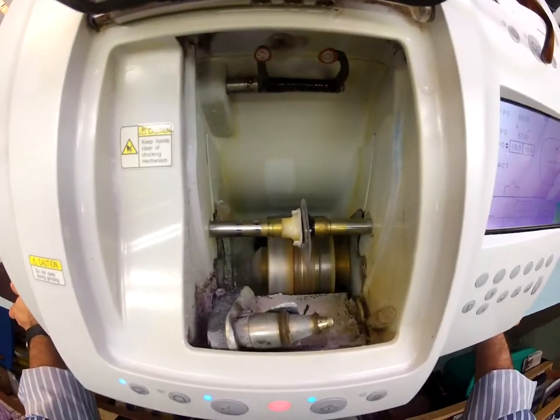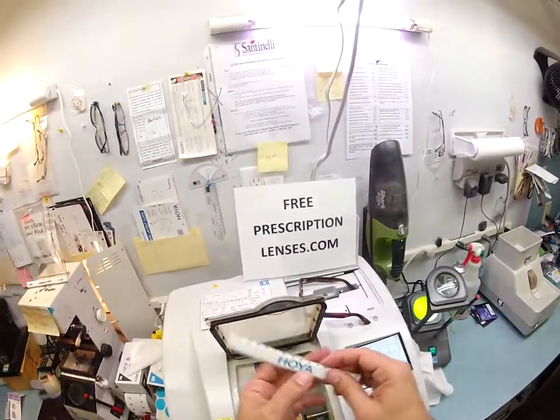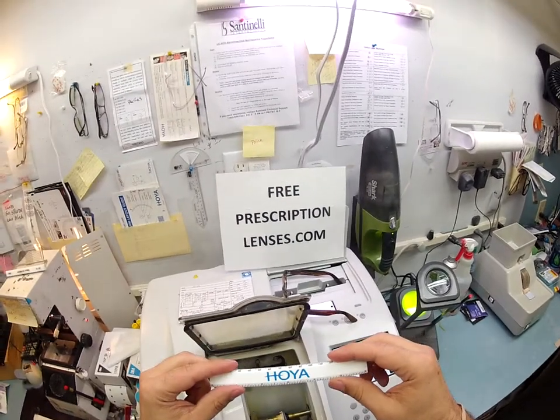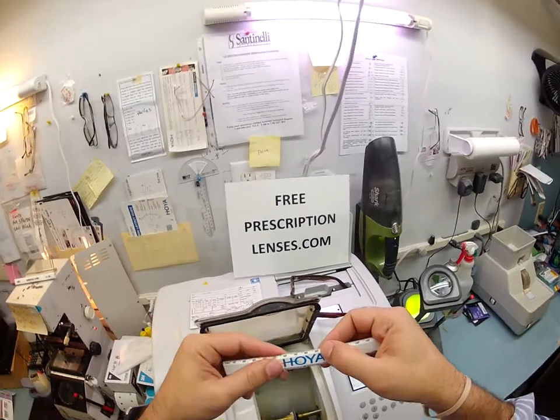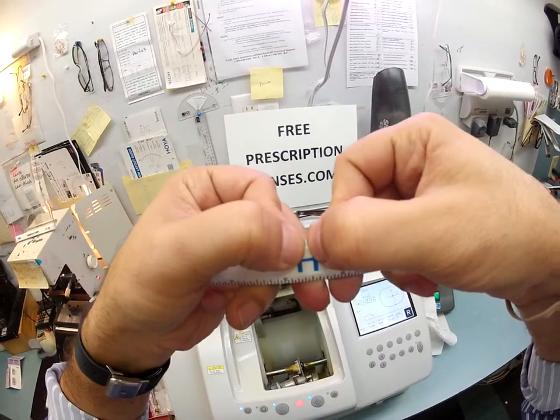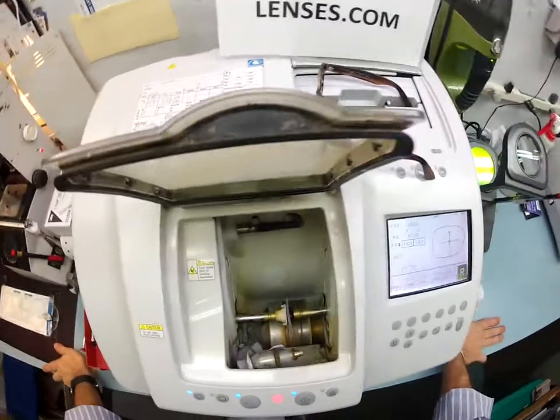Now, it's bypassing the cutting wheel and going straight to the bevel wheel. And 1/10 of a millimeter, we know what an inch is. There is 2.54 centimeters and there's 25.4 millimeters in an inch. So a millimeter is the distance between my thumbnails. I'm going to take 1/10 of that off, going around the circumference of your lens until it snaps in perfectly.